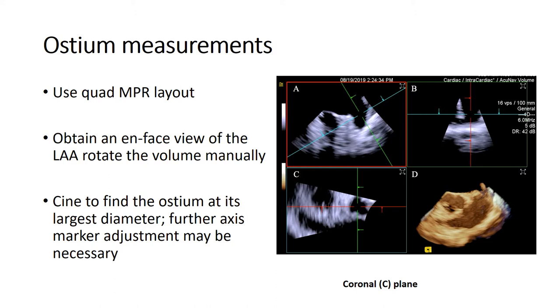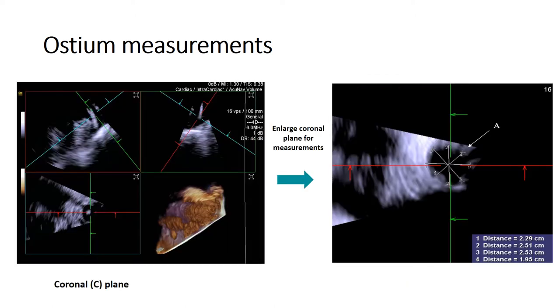Once the ICE catheter is in the left atrium, find the best 2D view of the left atrial appendage. Then switch to multi-planar reconstruction or MPR quad layout imaging to assess left atrial appendage morphology, including depth and ostium dimensions for device sizing. You can optimize the crosshairs in multiple orthogonal views to find proper coaxial alignment and measurements.